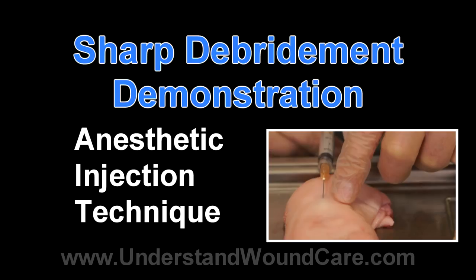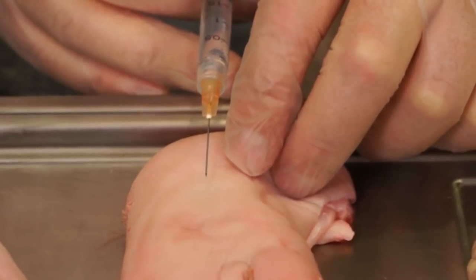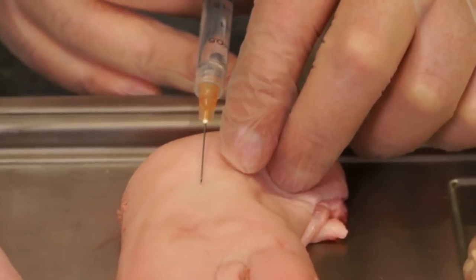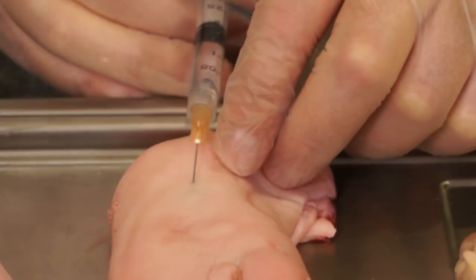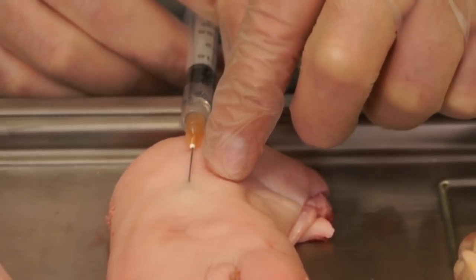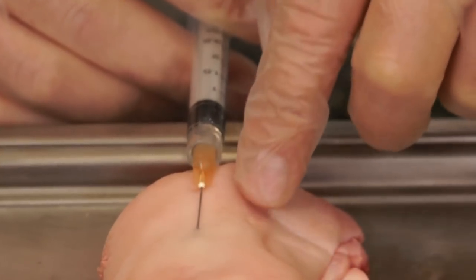When performing debridement of a black eschar of a pressure ulcer etiology, commonly the only area that is sensate and may cause discomfort to the patient without adequate anesthesia is the interface between necrotic tissue and the healthy remaining skin. To adequately anesthetize the area for debridement, a small wheal on the edge of the healthy skin can be created with injectable anesthetic. This is then extended underneath the area to be debrided in a fan-like fashion.